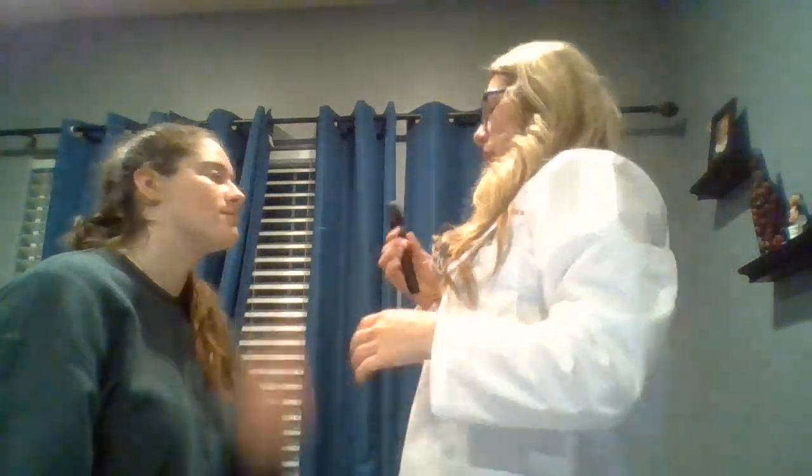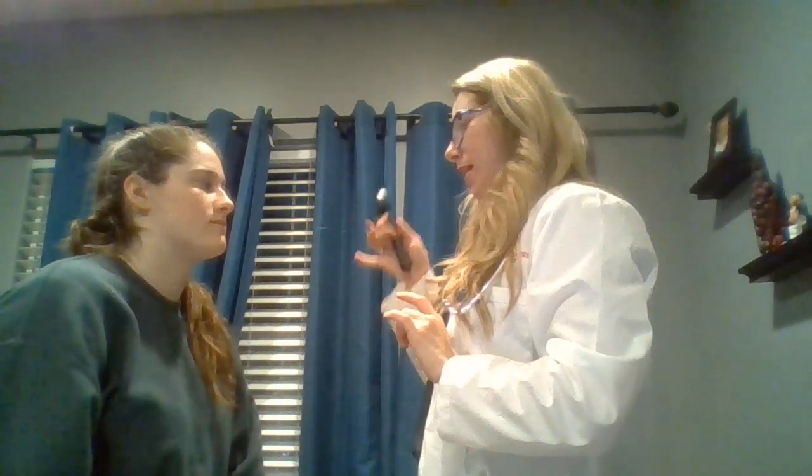Okay. I'm going to be doing each eye individually, okay? And I'm doing right eye to right eye. Okay, ready? Okay, I'm looking at the optic disc and the cup and the associated blood vessels.